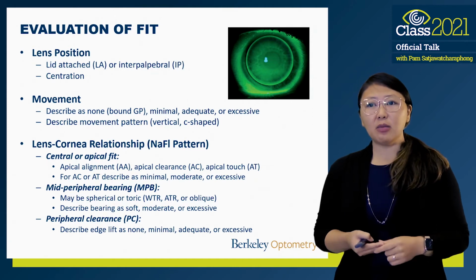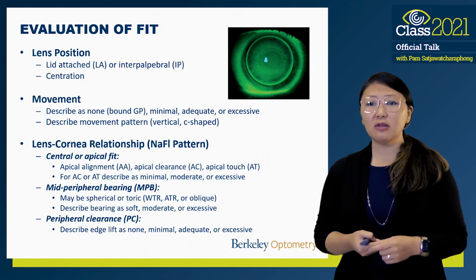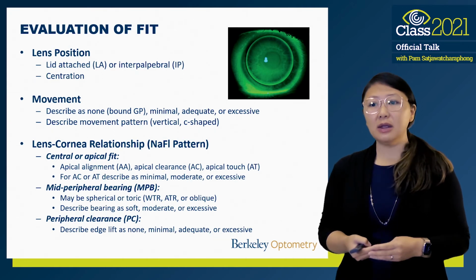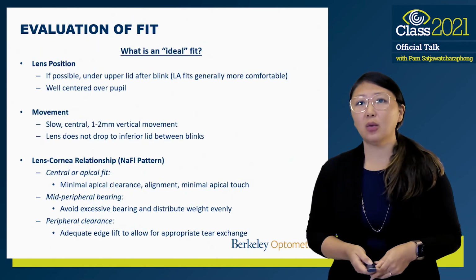The last thing I describe with the fluorescein pattern is the peripheral clearance. How is the edge looking? You can describe the edge lift as none, minimal, excessive, or even adequate. So what is an ideal fit?